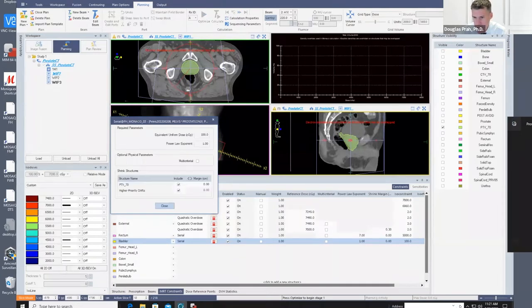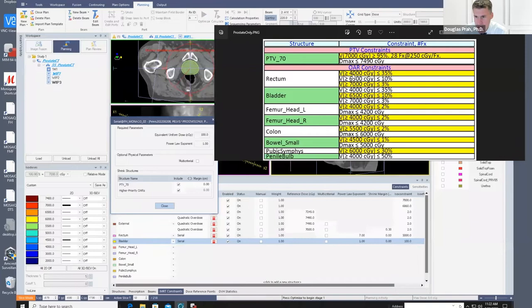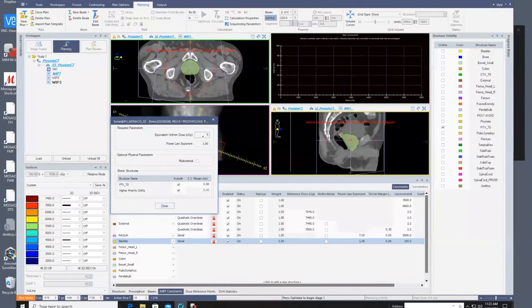So the nice thing about the serial is I don't have to put a constraint in for each of these values, some DVH value. Instead, think of the equivalent uniform dose as like an equation, right? Where your mean point dose line is passing through. So can I annotate here? So like if this was my 5,000 point line and I'm controlling a line through here like this, right? And then as I increase the power law exponent, the pitch of this gets steeper. So in this case, this would be like a K equal 10 here. And this line here is more like a K equal 5.